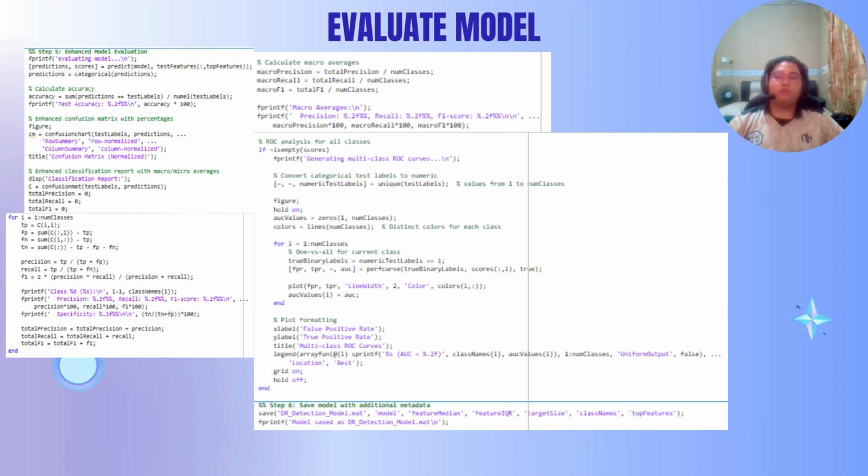The evaluation framework provides clinicians with overall accuracy for quick assessment, detailed class level metrics to identify weak points, visual tools to understand model behavior, and lastly statistical rigor through AUC and normalized metrics. For your information, our model's overall accuracy is 48.60% only. That's all for this code.